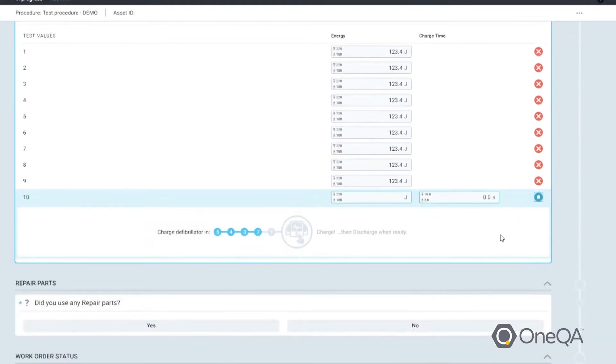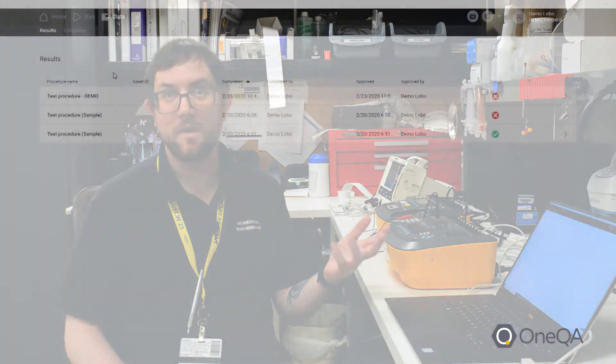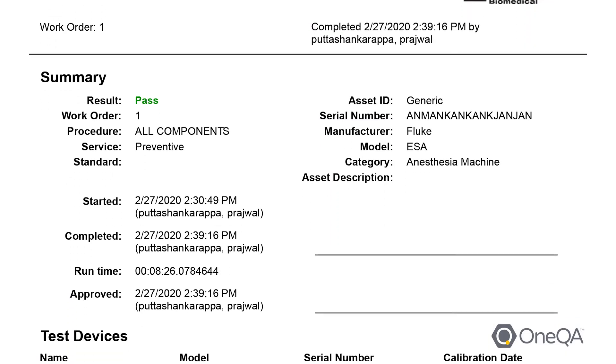It does explain to you what to do on each step. It's a lot easier than doing it manually and having to write all the results down and then record them later, because it makes the report automatically. I can just export the report and it makes it a lot easier.